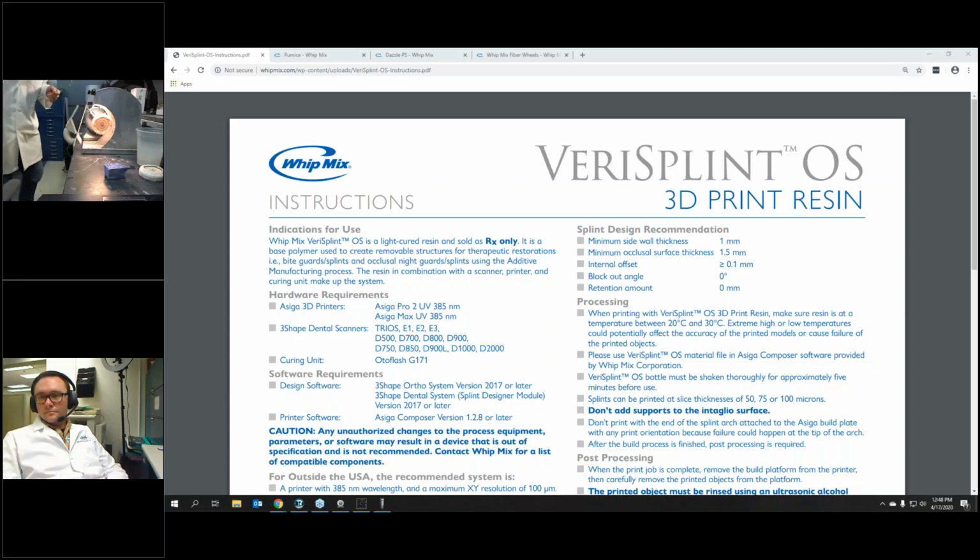So if y'all can see up close now, we can see how transparent these are. Both of them are looking really good. The final step that I have is to place some mineral oil on that intaglio surface. This is an extremely expensive, fancy brand of mineral oil from Kroger. I couldn't find any Q-tips, so I have a test swab. I'm going to use the swab and put a little bit on. I'm only going to do half of it. I did not think about grabbing a Q-tip before this; it would have been a little more helpful.